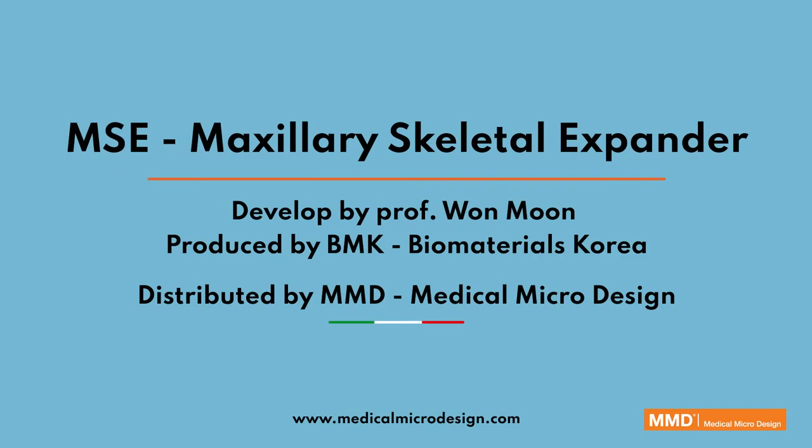MSE, maxillary skeletal expander. Developed by Professor Won Moon. Produced by BMK. Distributed in Italy by MMD.